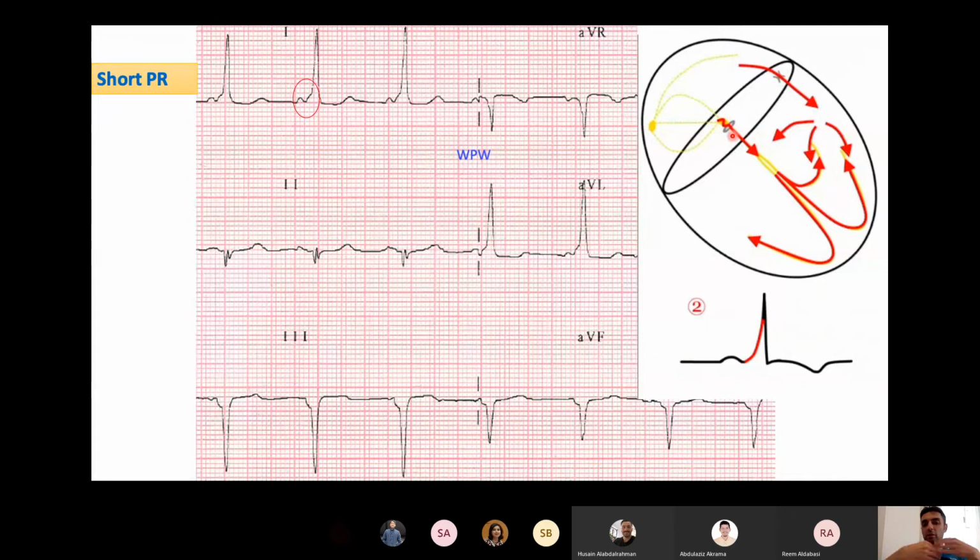Yes. Okay, and also because normally the QRS axis is between 0 and 100 degrees, because the heart is positioned in your left chest, with the left ventricle being a little bit more posterior, the right ventricle a little bit more anterior, and the vector of the electrical activation going towards the left and inferiorly.